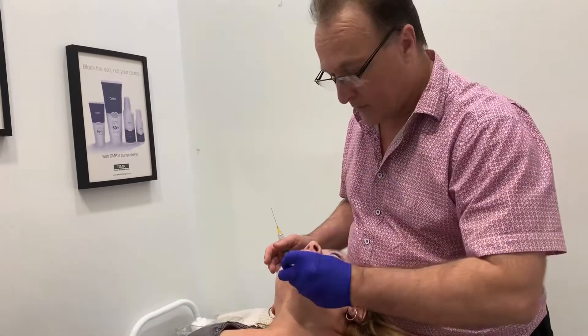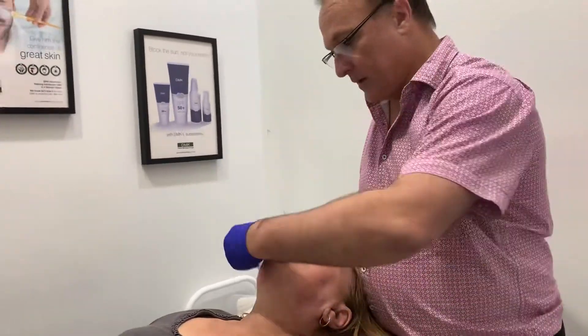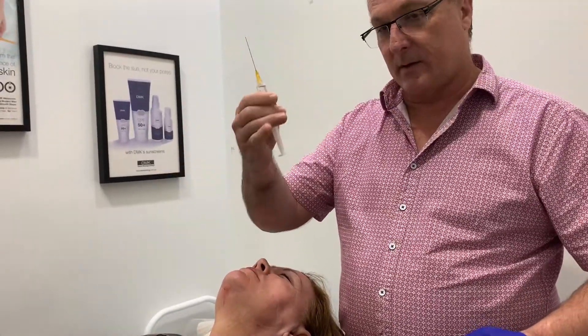The first part of the treatment I'm going to be doing with a cannula. The second part of the treatment I'm going to be doing with a sharp needle. So this is the product, this is the cannula.